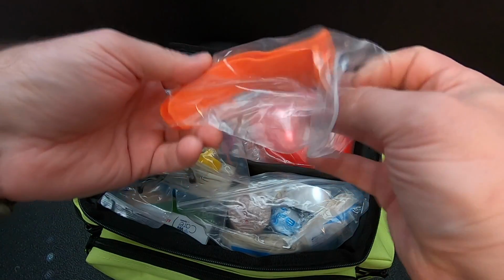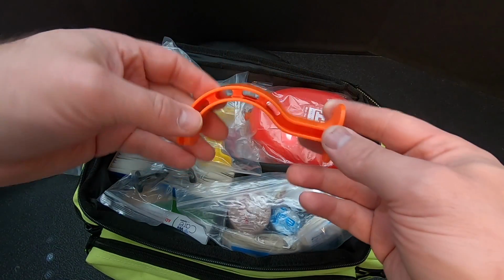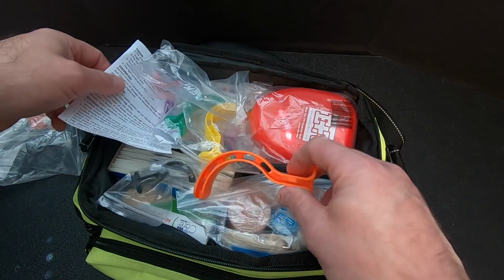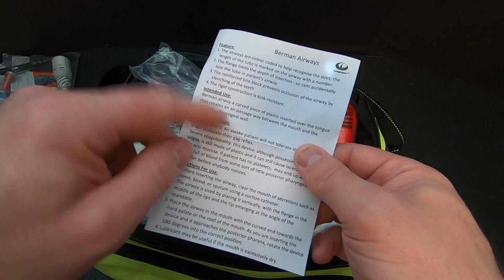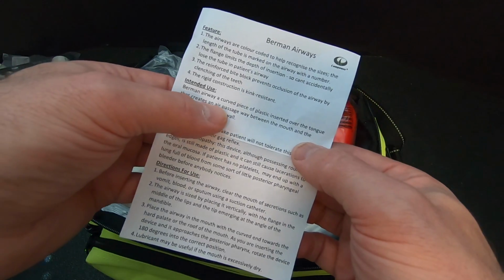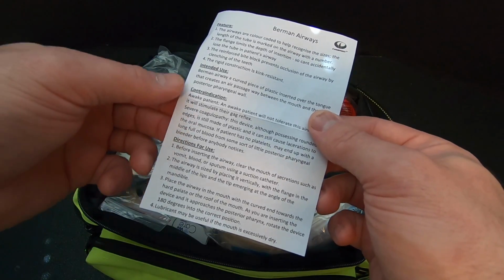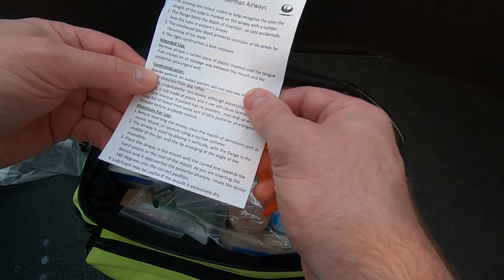So now I'm going to have to research this because I want to know how to use these properly. But basically, this is to open up the airway, so it pushes the tongue down and creates a passageway so they can breathe. And it says right here, it's a curved piece of plastic inserted over the tongue that creates an air passageway between the mouth and the posterior pharyngeal wall. Contraindications when not to use it, and directions for use. This is definitely something I'm going to have to Google.